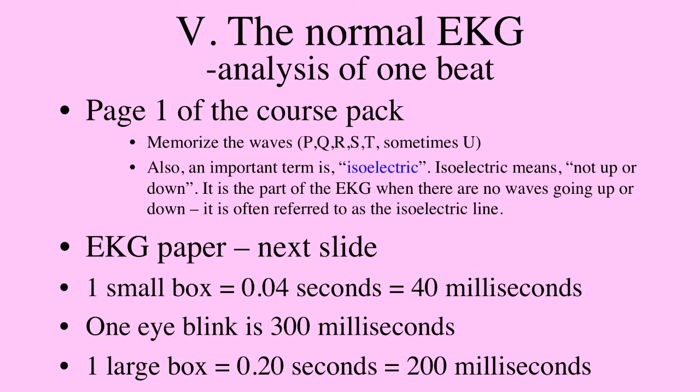This is a depiction of a potential setup. There is some variability. One thing to mention here is the R wave always deflects up. It can never deflect in a downward direction. The Q wave and S wave always deflect downward all the time. So QRS has its set deflection: upward for the R wave, downward for the Q and S waves.